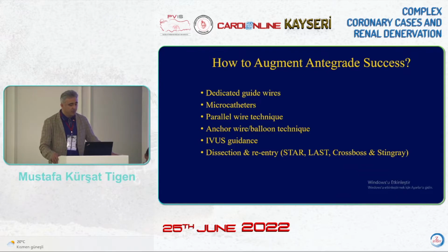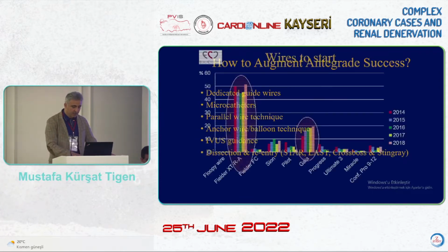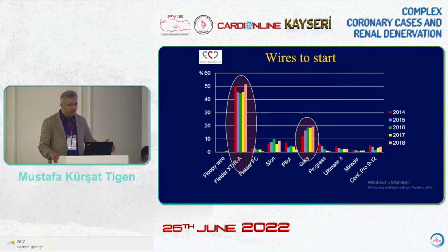Of course, we should use dedicated guide wires and microcatheters, and the parallel wire technique is important, and IVUS guidance is important, and these increase the success of the antegrade technique.